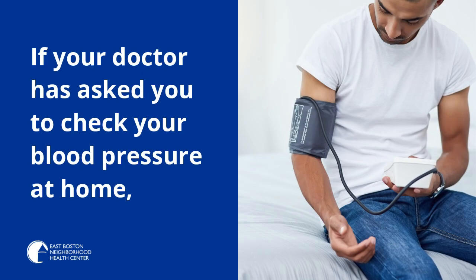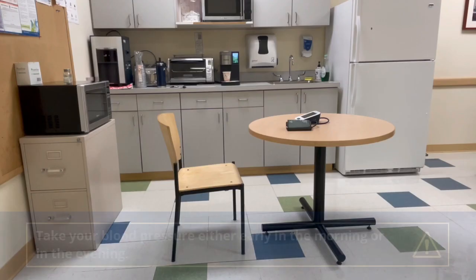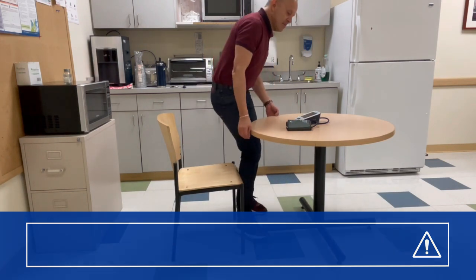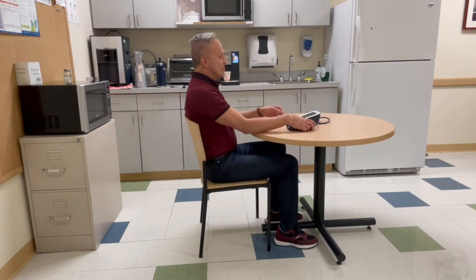If your doctor has asked you to check your blood pressure at home, it is important that you do it correctly. The best time of day to take your blood pressure is either early in the morning or in the evening when you have time and feel calm. It is important to relax and sit comfortably for five minutes before taking your blood pressure.